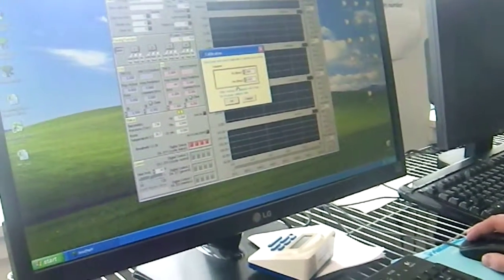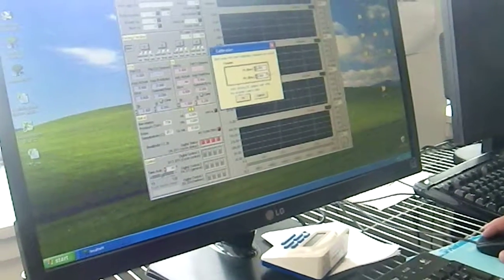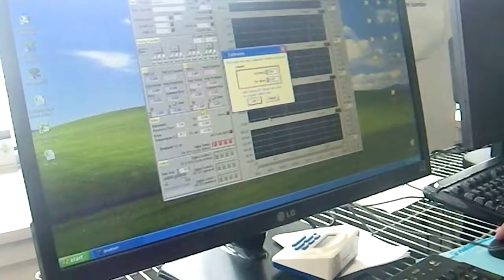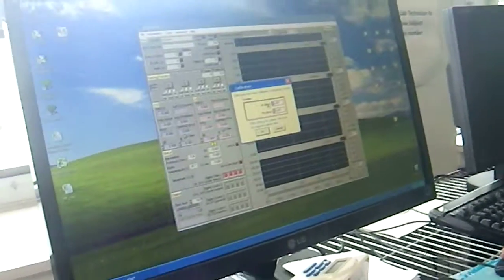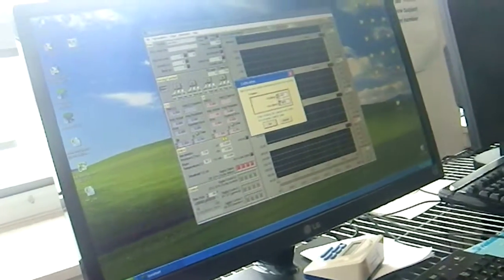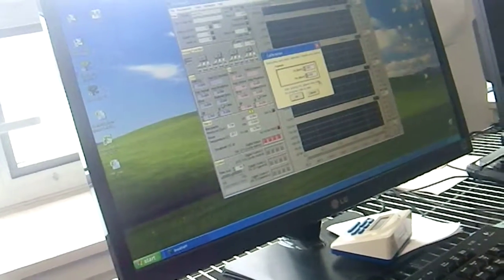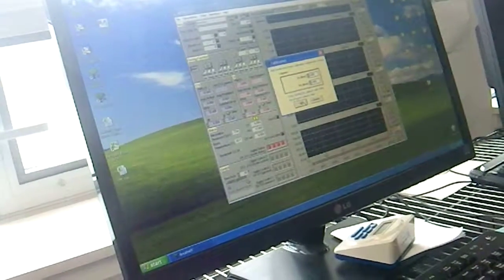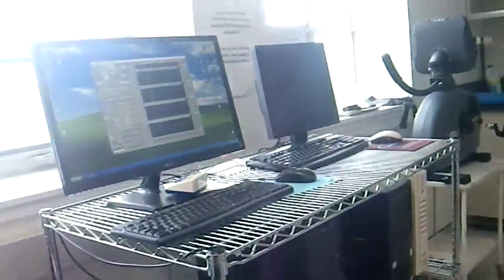So now it's going to measure volume. So that syringe is set to 3.003 liters. That's a known volume. So what we're looking at here is the discrepancy between what I'm actually pumping and what the machine is seeing. Then I can put a correction factor on to make sure we get accurate volumes. So you just go through the plunger, and you'll see the data come up on the screen.